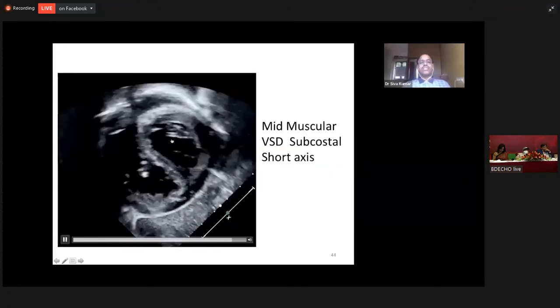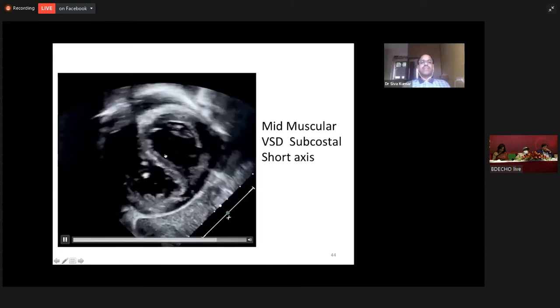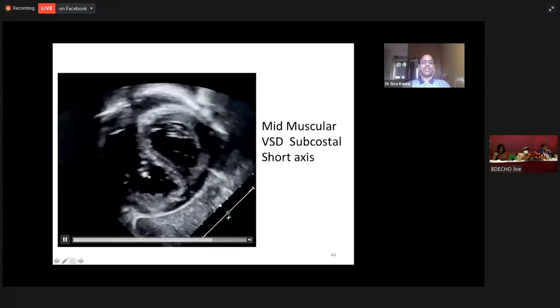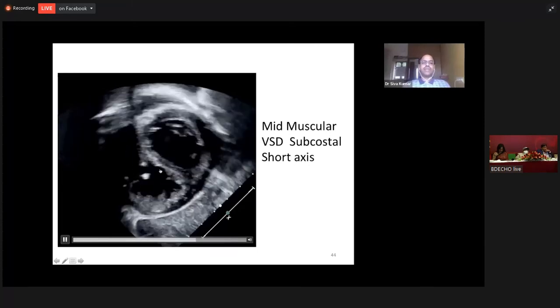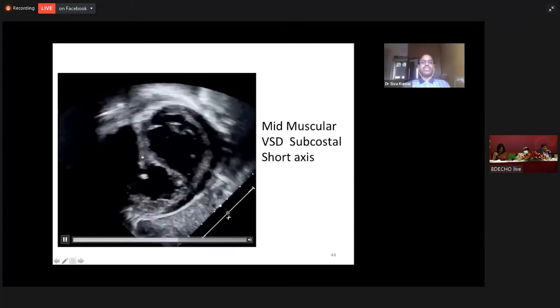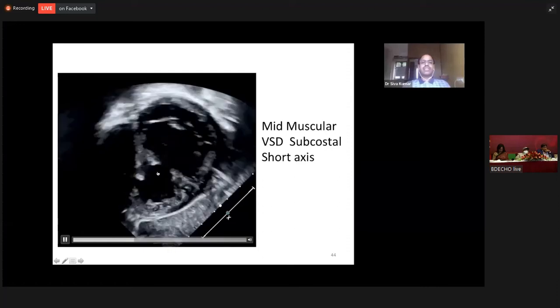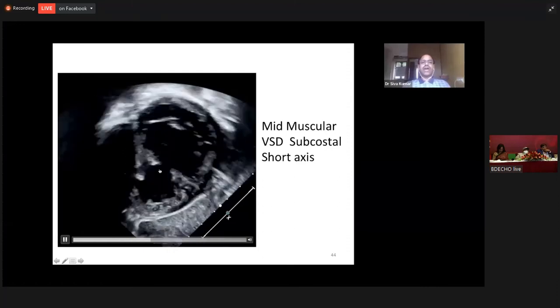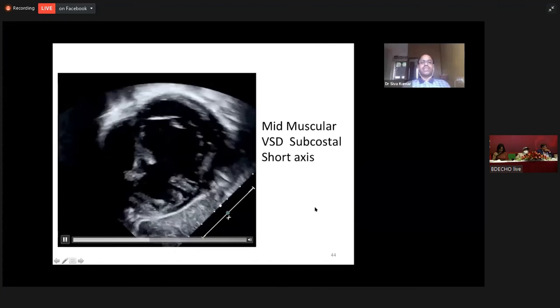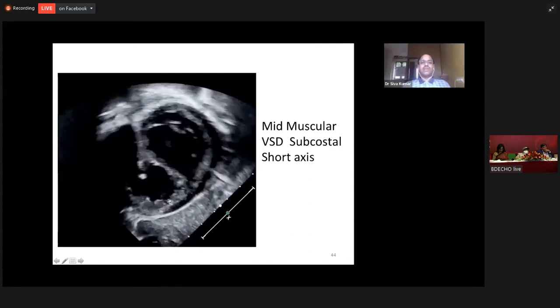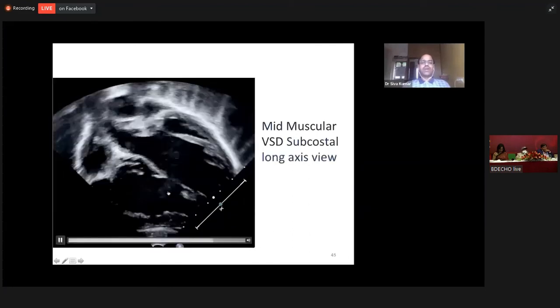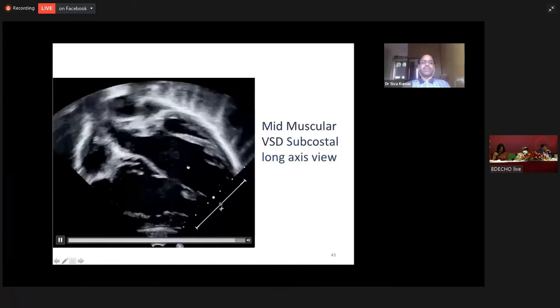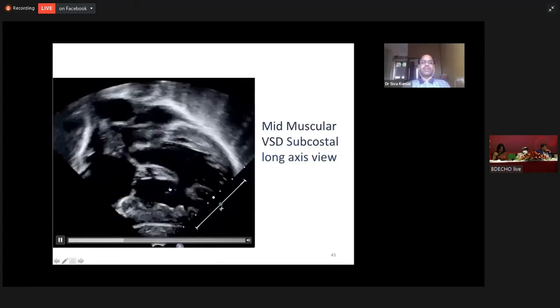This is a subcostal view of a large mid-muscular VSD. Mid-muscular VSD is located in the mid-portion of the trabecular septum. You can appreciate the septal band here — it is inferior and posterior to the septal band. The same VSD can be seen in other views. This is a subcostal coronal view — you can appreciate the right ventricle and left ventricle here with a large mid-muscular ventricular septal defect.